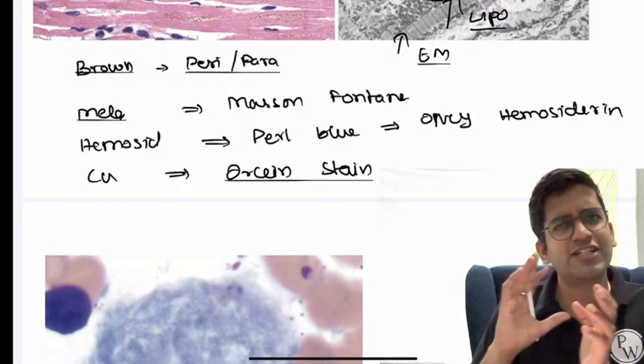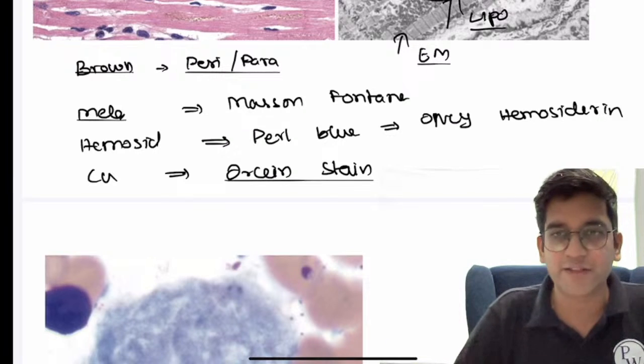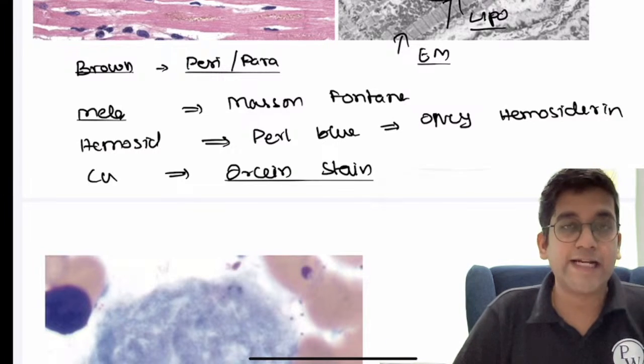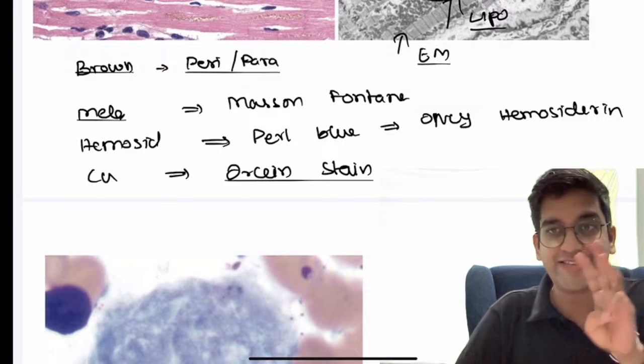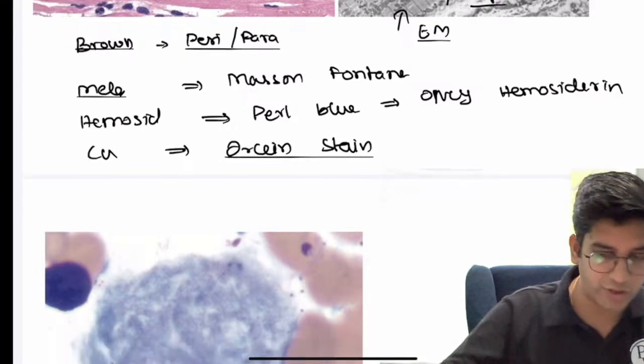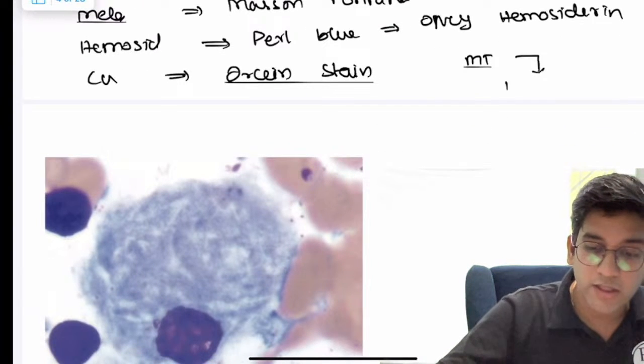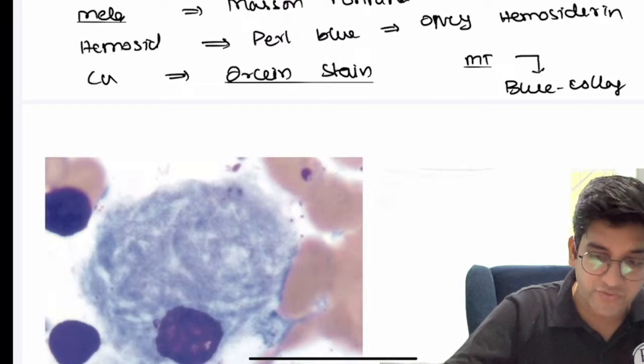Rishabh, I think we will discuss these things later. These are for NEET PG exam going students. We'll quickly cover things. It's Masson's trichrome. Great. In Masson's trichrome, as the name says, there are 3 colors, right? What will be the color of collagen in case of Masson's trichrome? You guys are right. What will be the color of collagen? Collagen will be blue in color, right? Blue color will be for collagen, one of the 3 colors.